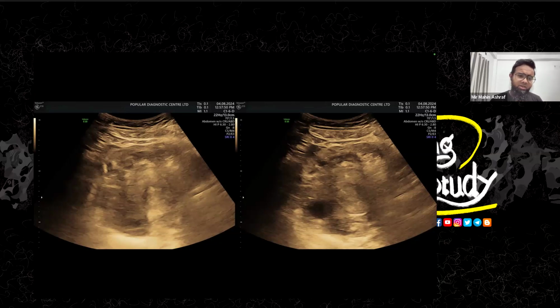and you can see the patient had severe lower abdominal pain actually, and we can see something abnormal happening at the lower abdomen. So we need to examine the patient with a full bladder, or we should go for the transvaginal ultrasound. So it's a difficult situation right now.